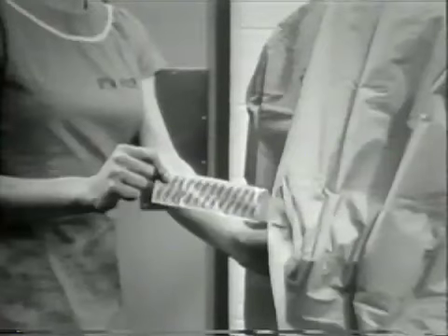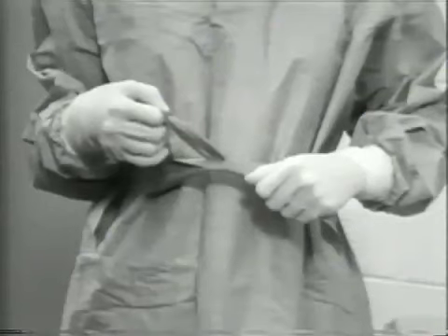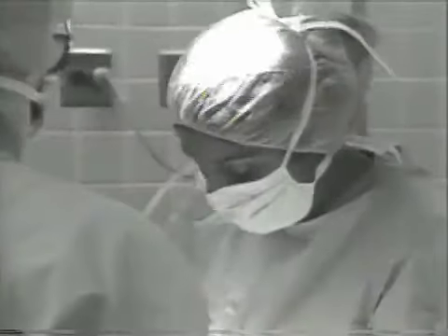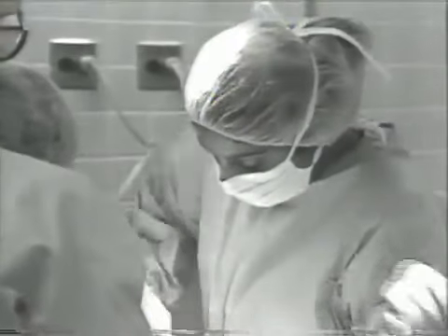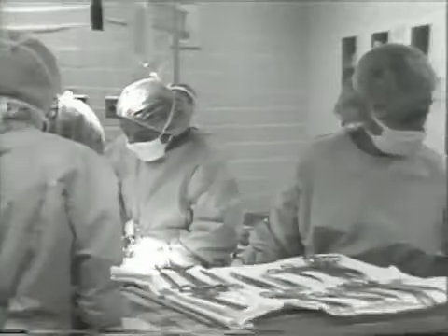How does she tie her gown? She turns counterclockwise, taking the protected tie from the circulating nurse, and ties it to the other end on the front of her gown. Gowning and gloving are now completed, and you're ready to participate in the operative procedure. Identify for yourself the sterile and unsterile fields, the scrubbed and unscrubbed personnel. This will guide you in maintaining asepsis.